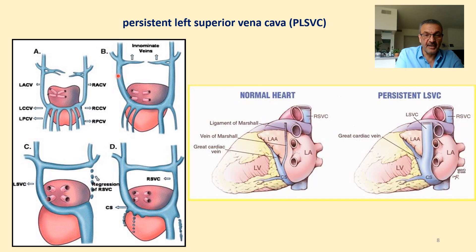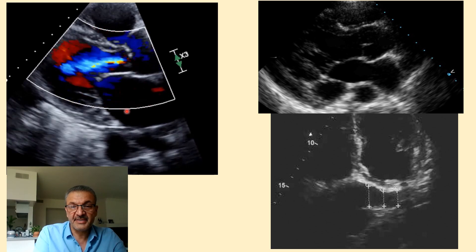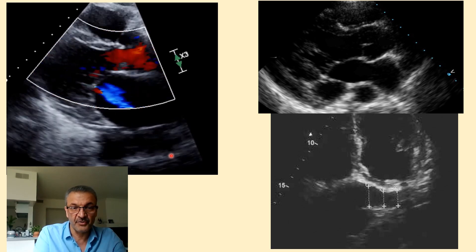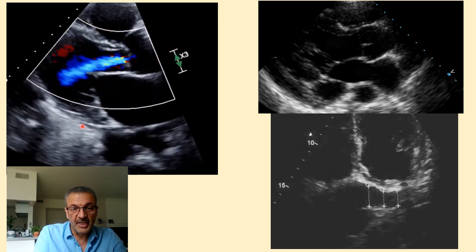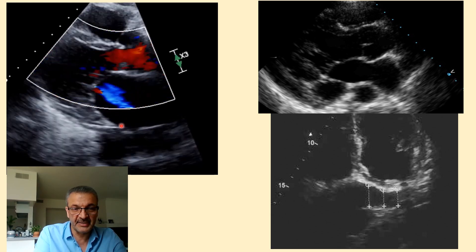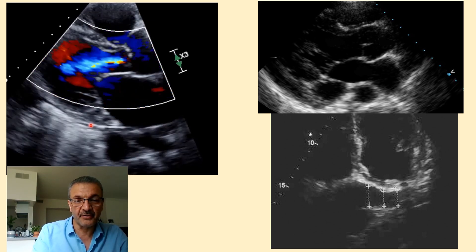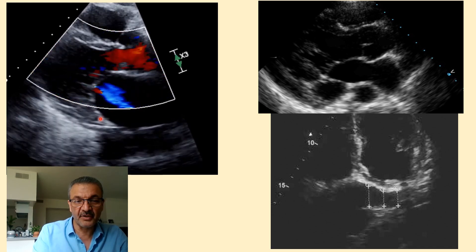So this left superior vena cava joins the coronary sinus and through that drains to the right atrium. Let's see how we detect and diagnose this with bubble test — first, how we visualize the coronary sinus on echo. In a normal situation, the coronary sinus is located at the atrioventricular junction. The atrioventricular junction appears as a circular shape. The coronary sinus is a circular hypo- or anechoic structure, anterior to the pericardium. Here is our pericardium, and this small circular anechoic structure is the coronary sinus.